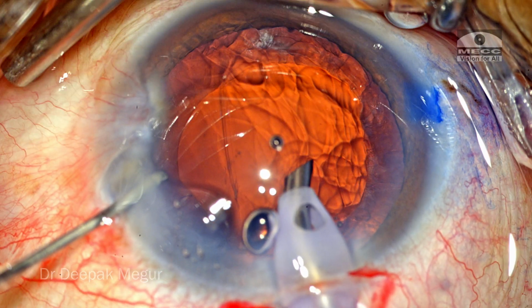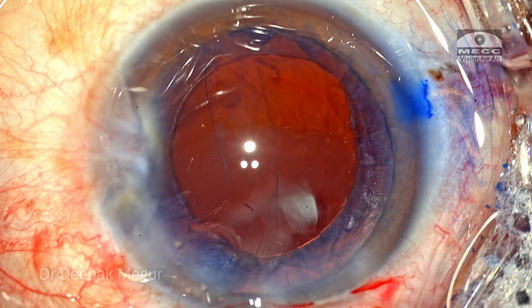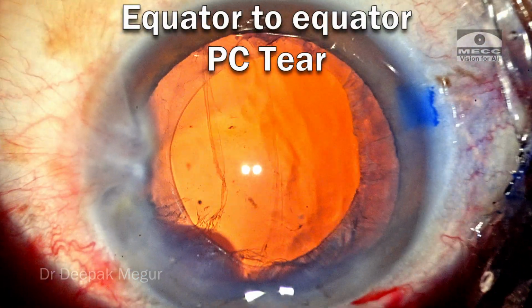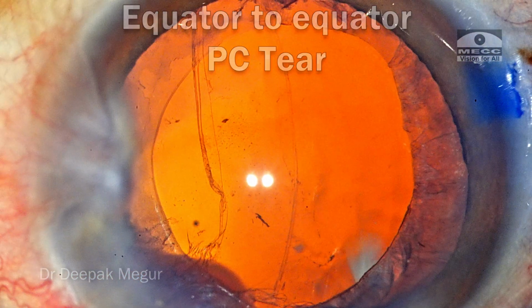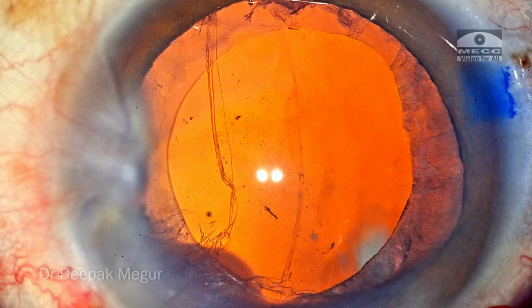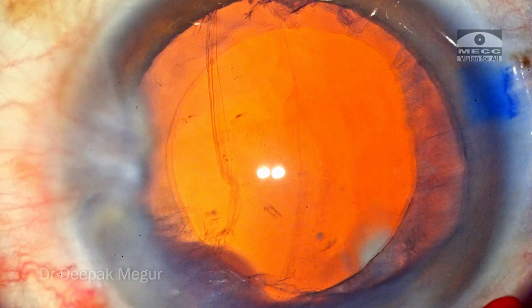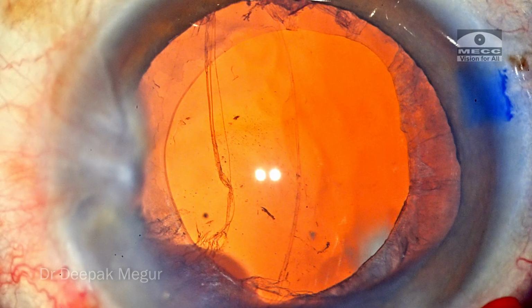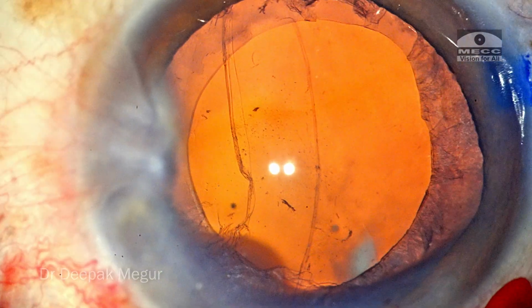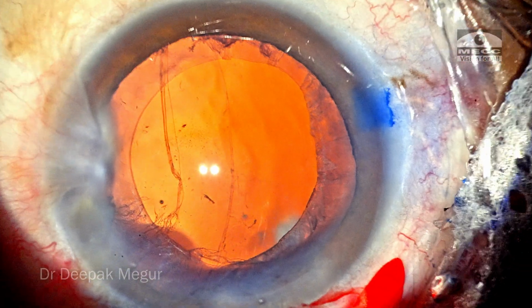The irrigation is turned off. The handpiece is out now. As I center my microscope, I can clearly visualize things now. An equator to equator posterior capsular tear is staring at me. The small fluffy cortex has dropped down, and the vitreous seems to be present at the level of the posterior capsular tear. Since the posterior capsular tear edges are not flayed wide open, I suspect that the vitreous prolapse into the anterior chamber has still not happened.